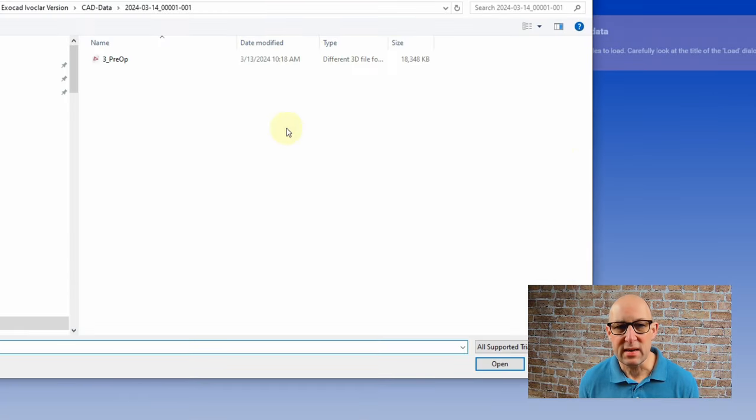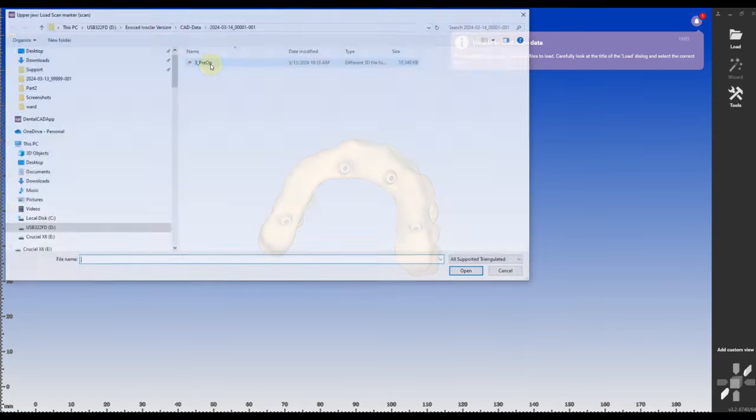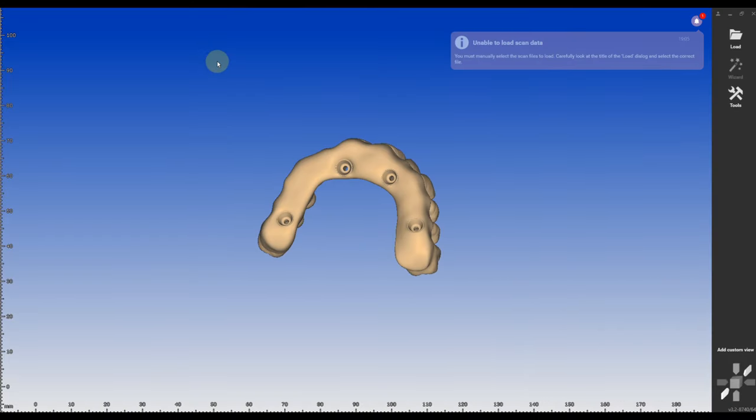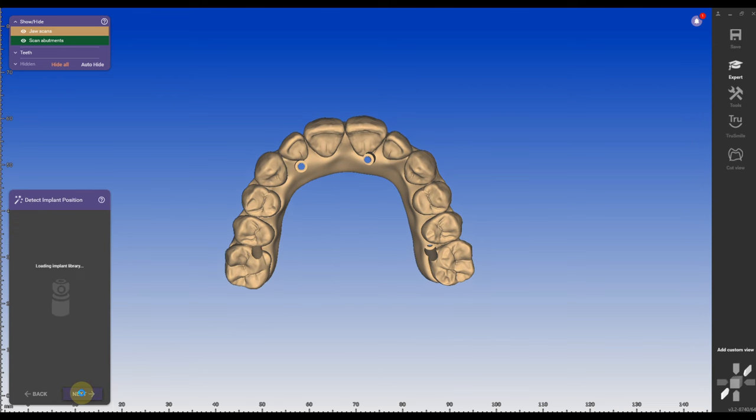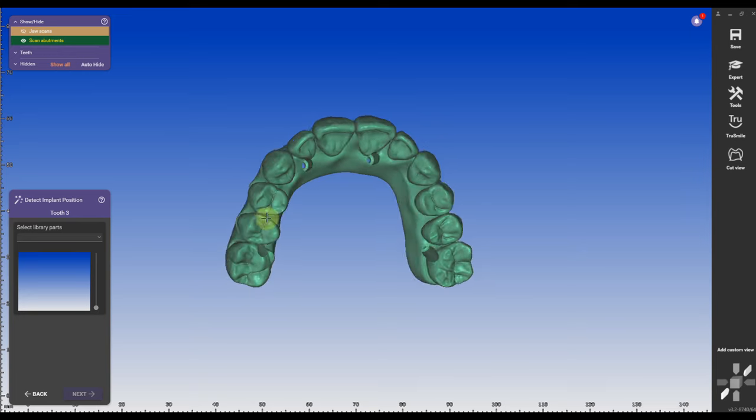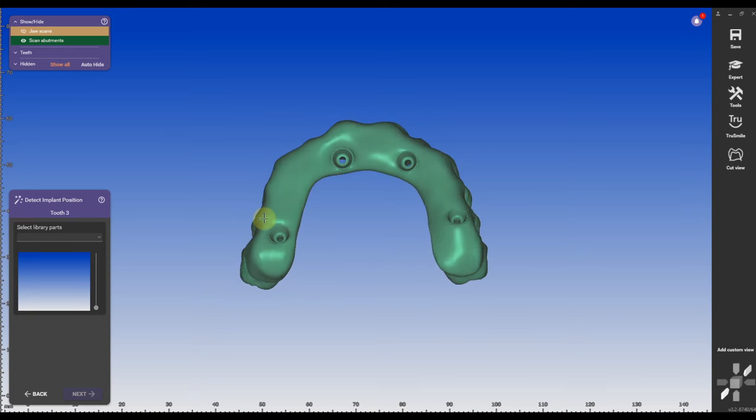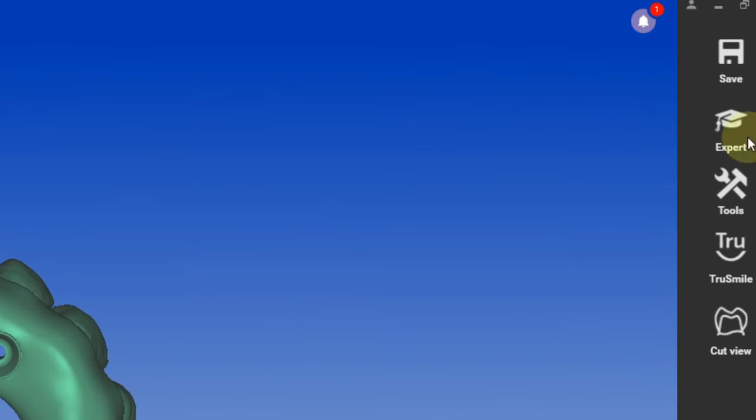We only have one scan and only this one scan we're going to import as our jaw scan and our scan body scan. Then before we're going to go into the library we have to modify our scan body scan a little bit which is our pre-op scan which is our scan that we have.